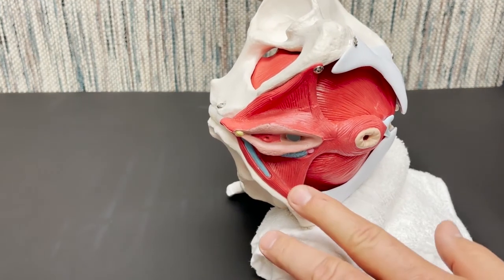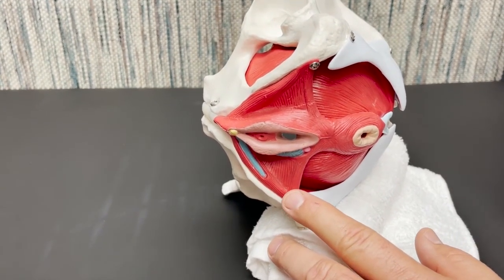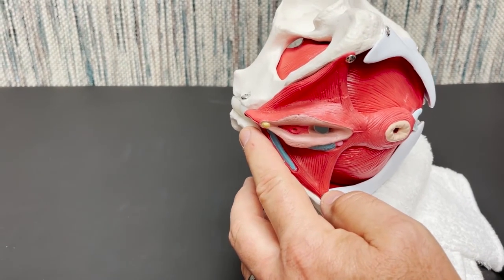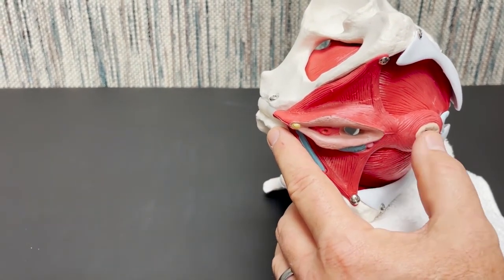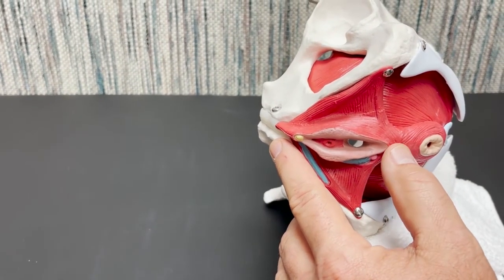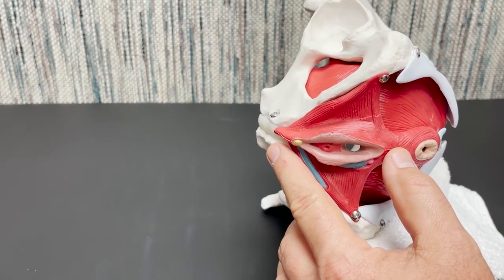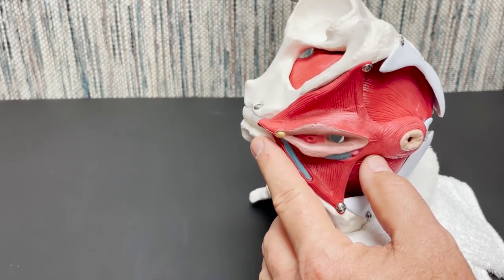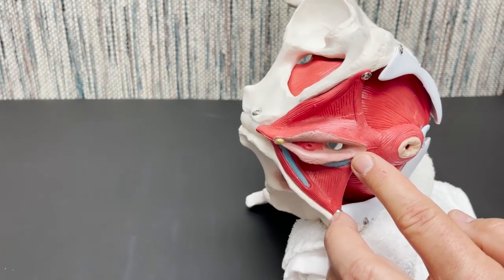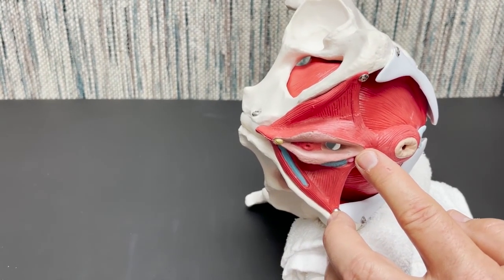Again, we're going to palpate for our ischial tuberosity and the pubic symphysis. We're going to note the location of the perineal body, which is going to be midpoint between the rectal orifice and the vagina. The needle location will be at the midpoint between these 2 points, directed laterally and superiorly, 30 to 45 degrees away from the internal organs.